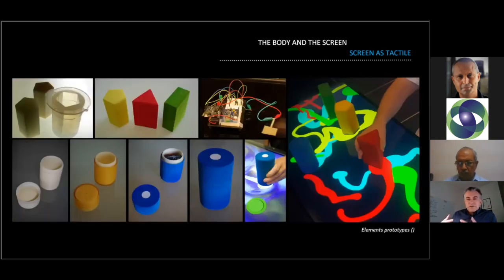Taking those concepts of horizontal computing further means incorporating more tangible and embedded user interfaces for interacting with digital things via physical artifacts, which we explored to develop EDNA.